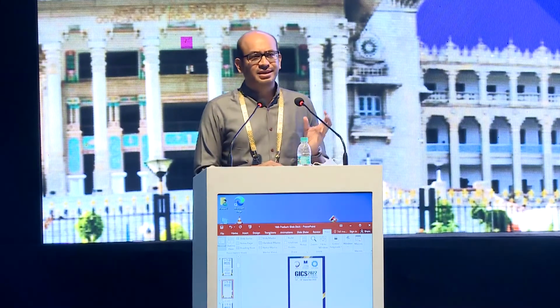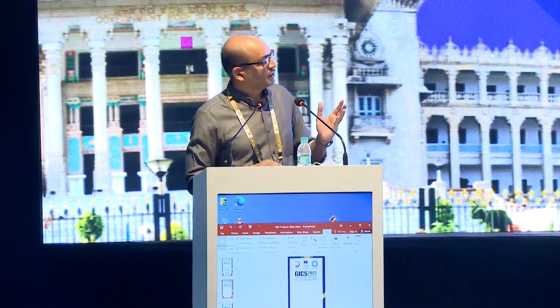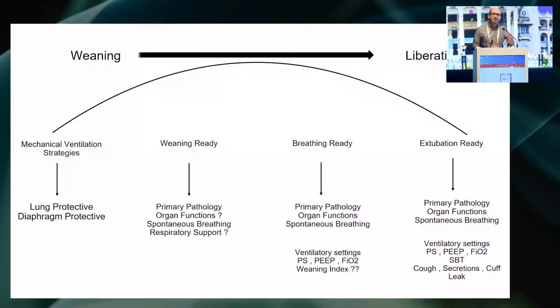For a long time, we considered weaning as a gradual process, where we gradually decrease the respiratory support. We looked at whether the patient was ready to breathe. Then, if the patient is ready to breathe, you look at various factors which can interfere with his breathing process. Then you did a few trials, and then you looked at whether the patient would be extubated or not. Now, a lot of data has suggested that if you go through this route, patients are probably going to spend a large amount of time unnecessarily. And that's where we have now started using the term liberation, where you see that a large number of patients need not go through this process.